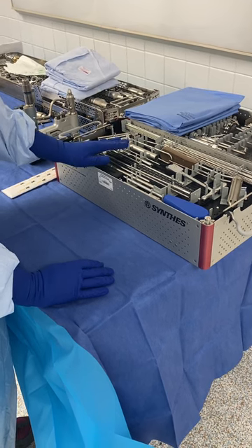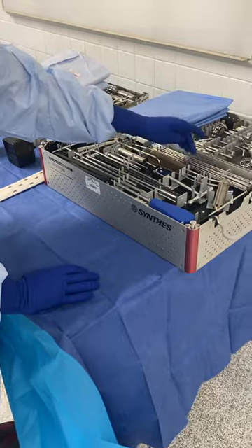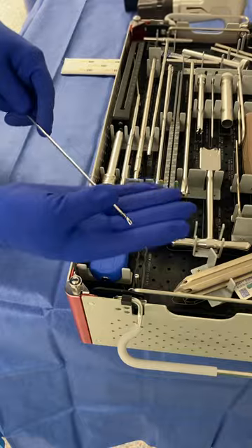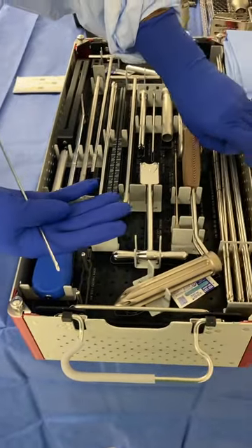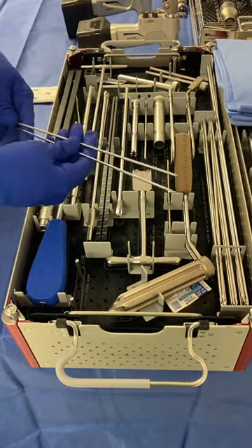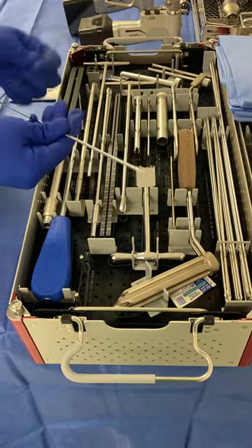I'm going to walk you through the tray quickly. These are all the K wires that are available. Some doctors like drill tip wires and some doctors like the thread tip wires, so it just depends on your doctor's preference. There are different lengths. My doctor likes the drill tips, so that's what I'm going to get out today.